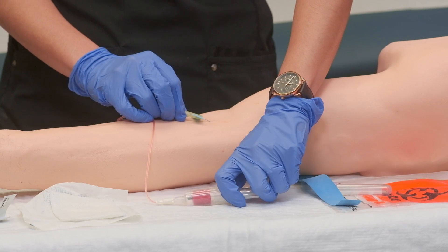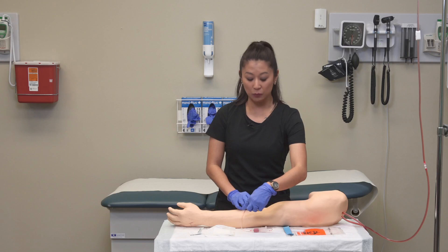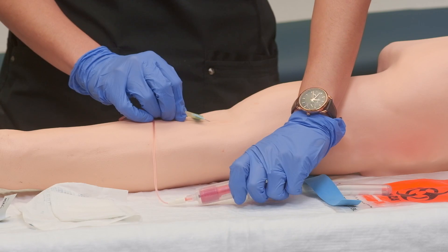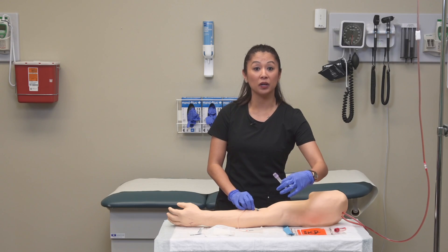Push the waste tube all the way to the top and it's going to fill. Once we determine there's no more air in the line, remove the waste tube by simply pulling it off, get rid of it, and replace it with our lab collection tubes.